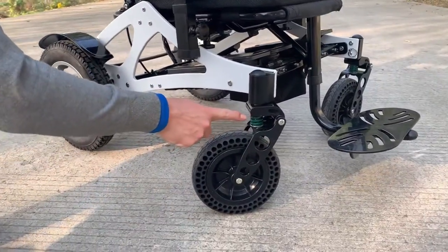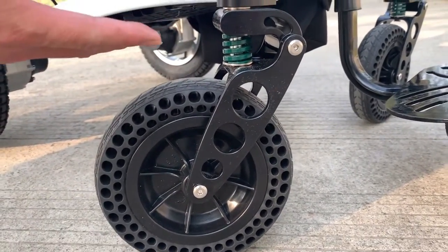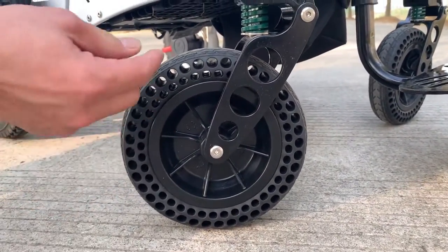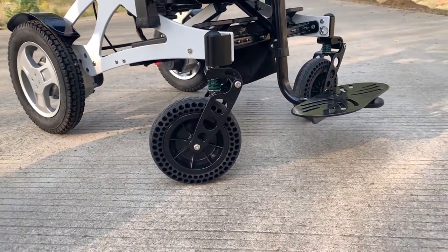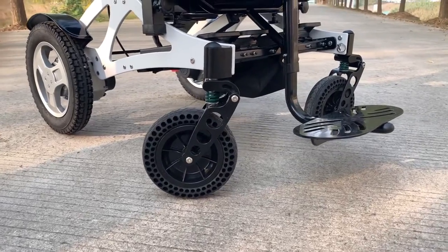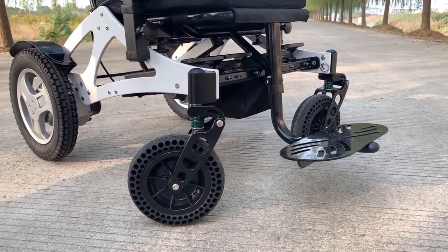We have increased suspension here. You can see a spring with green color there. Also, the wheel has a lot of holes to provide a suspension function — I would say it's a dual suspension function, which will bring you a lot of comfort while riding on rough terrain.